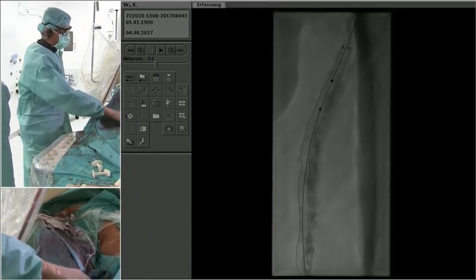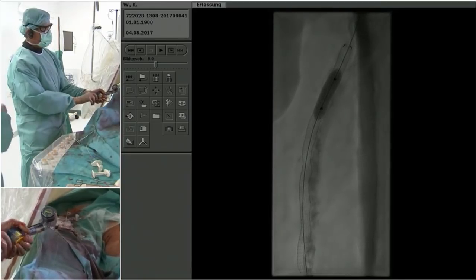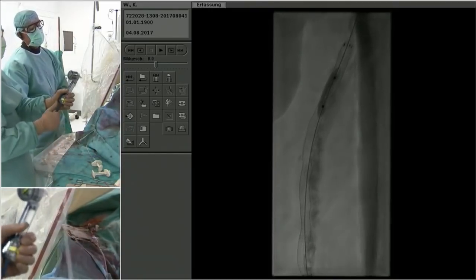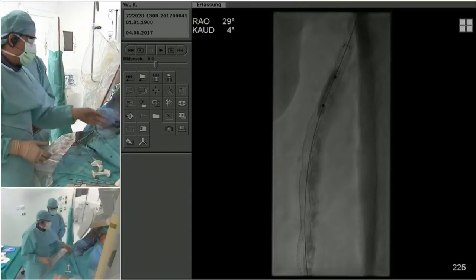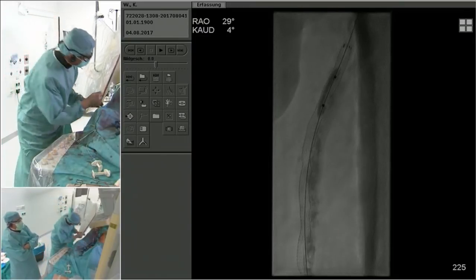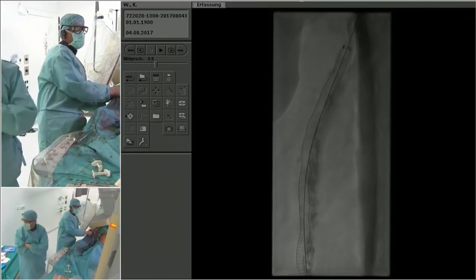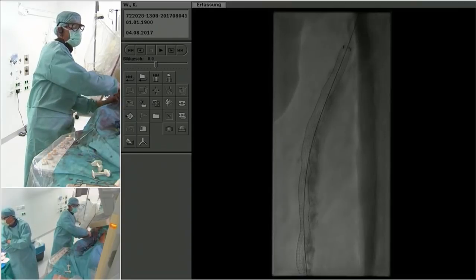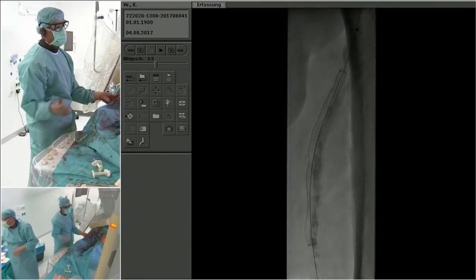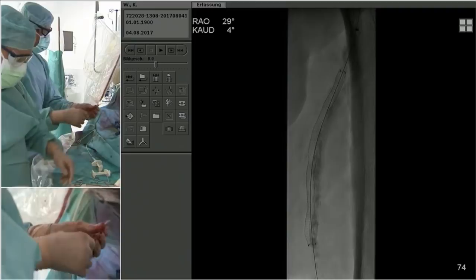Yeah, so you see here some recoil. It's not completely ruptured, that artery here. But it may be enough to take now a 6 millimeter balloon, in Conquest 27 or 28. And of course, you may also think that now it's open enough. And although this is not a stent with high radial force, it may be enough to prevent severe recoil.